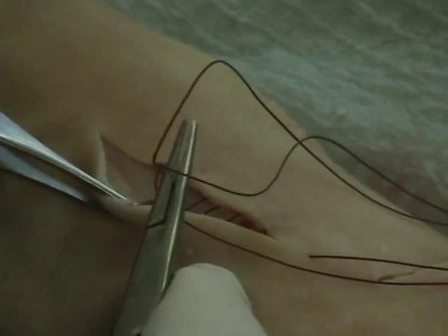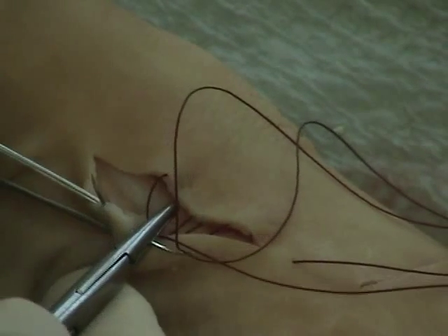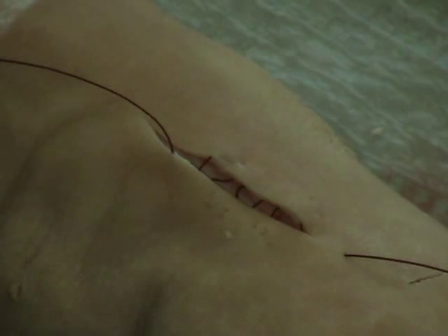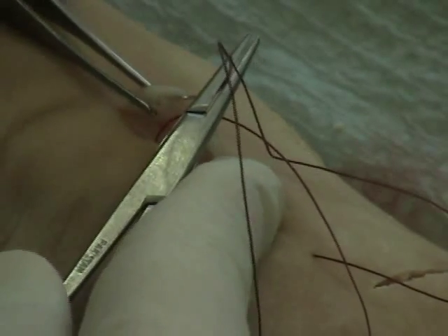I see where it's coming across, lift up the other side, go in the dermis again. I'm supporting it and guiding my needle through to make sure it comes out the side rather than the top. If it does come out the top, just back the needle up and reposition. Continue going across from one side to the other — go in the skin, move forward, and pop out.